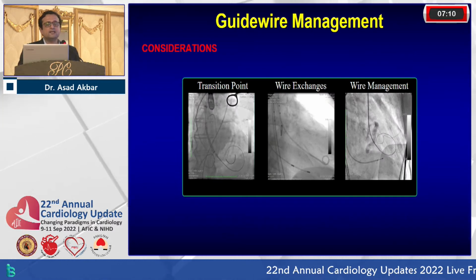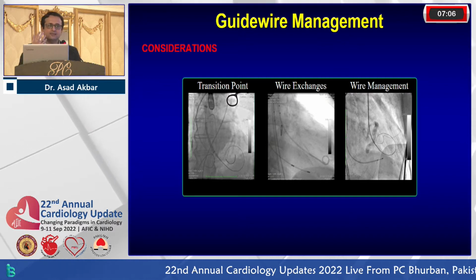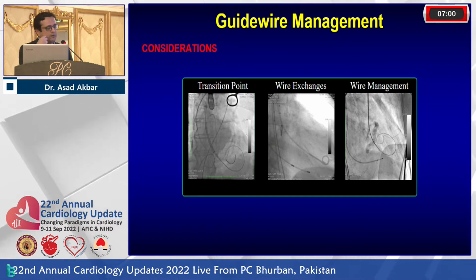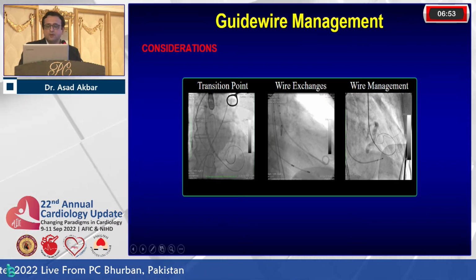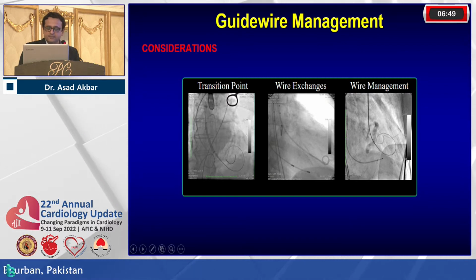The next thing is guidewire management. Last time, Nadir Sahab was saying this comes with a lot more experience, because a lot of times either it goes really lax or you pull it too much, and you can sometimes even pull it out. And one thing that we always miss out in all these preformed wires is the tip. So we'll see one case.